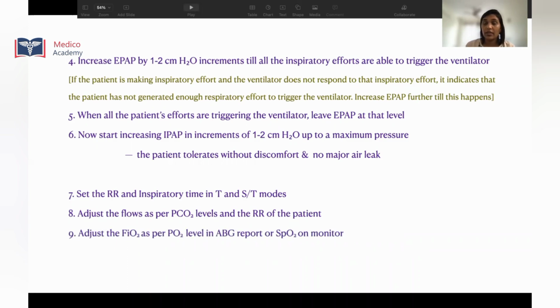The principle used in adjusting the flow is that when you have a patient with a high respiratory rate, as in respiratory failure, you should understand that they'll have very high flows, like 60 to 100 liters per minute. So in such cases, whatever oxygen device you apply to the patient should have a flow which is either equal or a little more than that, but never less than the patient's own inspiratory flow. We cannot measure it, but we can at least presume that a patient in respiratory failure will definitely have flows above 60. So use a device which can deliver flows above 60 liters a minute. In such a patient, if you give a conventional oxygen therapy device which can deliver flows up to a maximum of 10 to 15 liters per minute, then it is of no use.